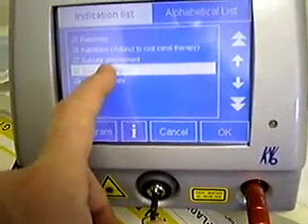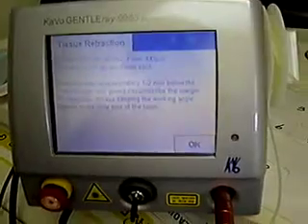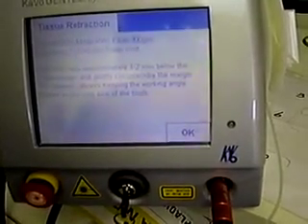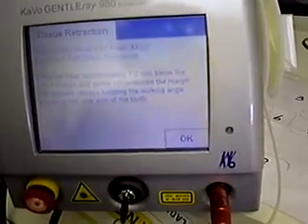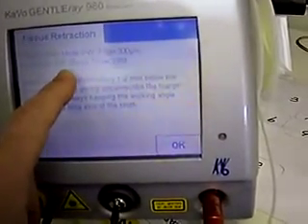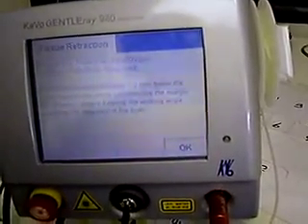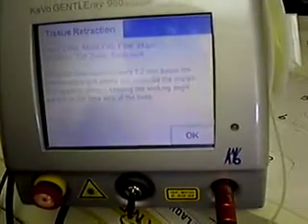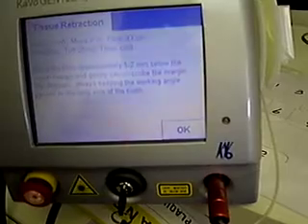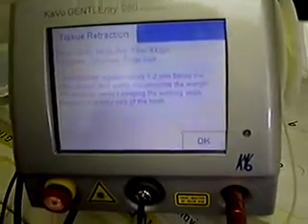In the indications list there are a number of different presets. We'll look at number 28, which is tissue retraction. We hit it on the touch screen, click information, and it gives you the parameters: a power of 2 watts in a pulsed wavelength using a 300 micron fiber — you can also get a 200 micron fiber. The pulse wave is 25 milliseconds on with 25 milliseconds off, which is very important to consider the rest period and avoid overheating tissue. It instructs you to place the fiber approximately 1 to 2 millimeters below the crown margin and gently circumscribe the margin 360 degrees, keeping the working angle parallel to the long axis of the tooth, because fibers and lasers are end-cutting only.